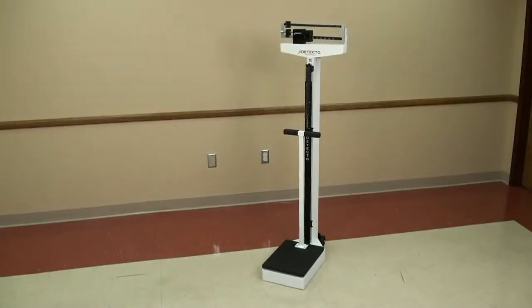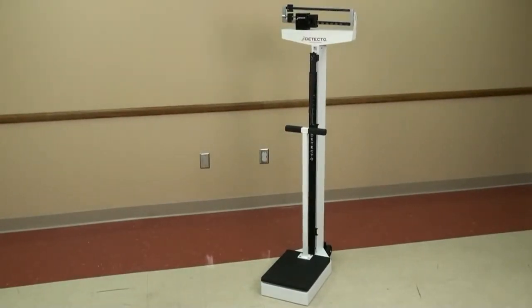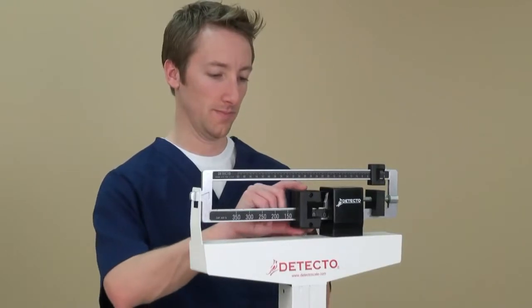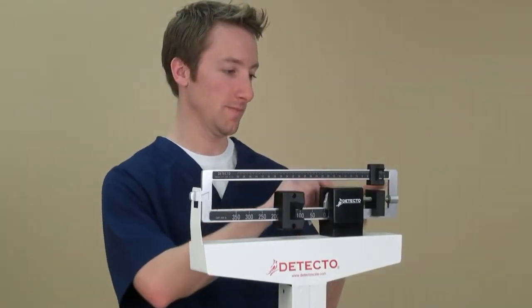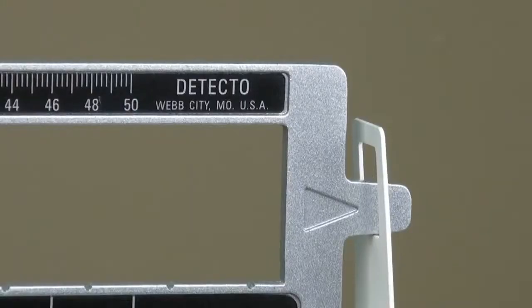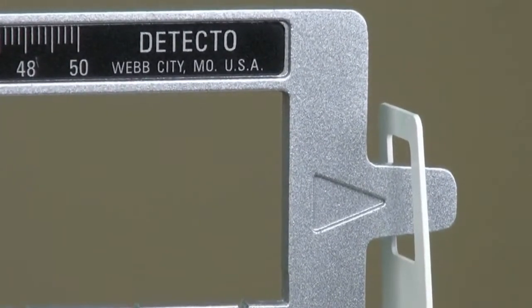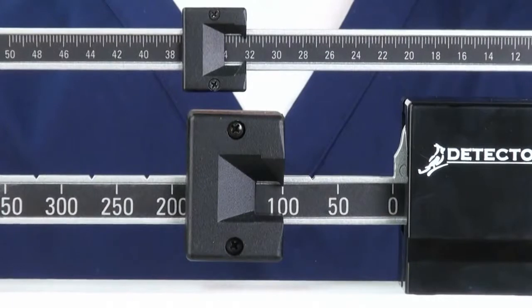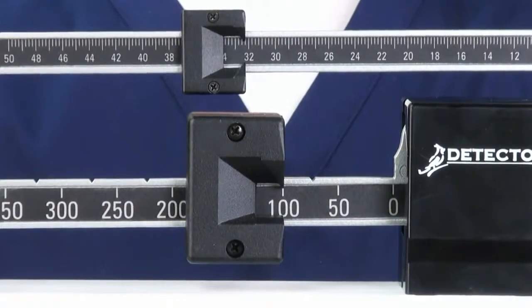The operation of Detecto's eye-level physician scale is incredibly easy. First, slide the larger poise on the bottom to the approximate target weight. Then, slide the smaller poise on the top until the waybeam balances. The combination of weight shown by each indicator is the total of the weight on the scale.